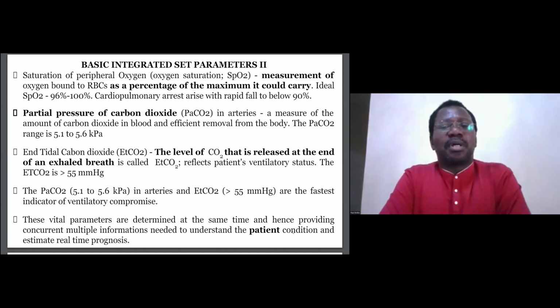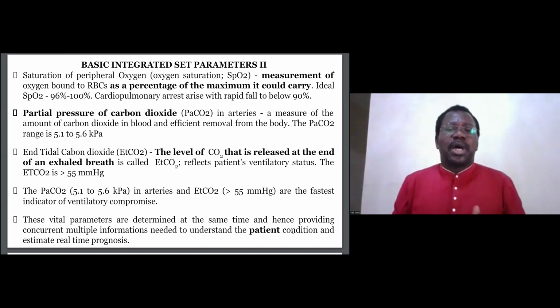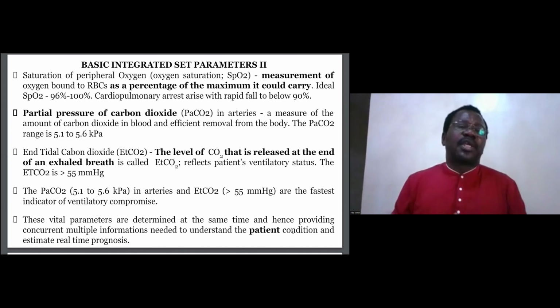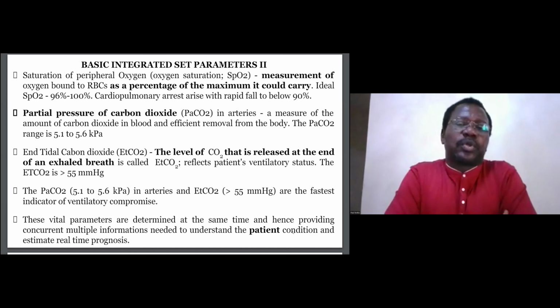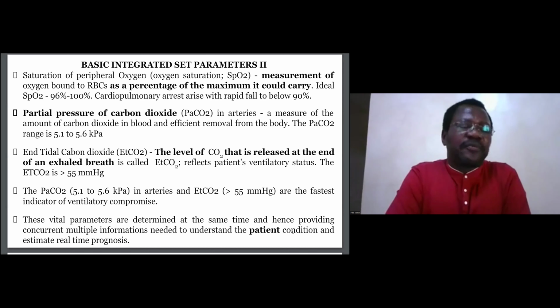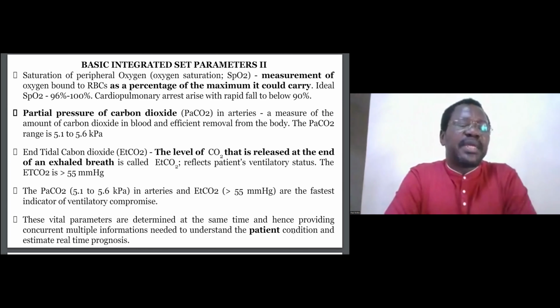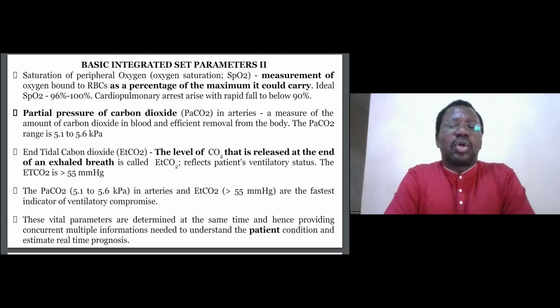So it's important. The key importance of this is if you take a PCV, sometimes in a patient, the PCV will look normal, but you don't know the SpO2. And then the condition of the animal keeps deteriorating. And then you wonder why, because the blood is supposed to be quantitatively okay, but probably if you take carbon monoxide poisoning, for instance, the PCV will be normal, but the oxygen carrying capacity of the red blood cells has been impeded by the carbon monoxide. So the PCV will be okay, but if you take the SpO2, it will definitely be below 95%. So you know at that time that something is wrong. So although quantitatively the blood looks okay, qualitatively there's some problem.